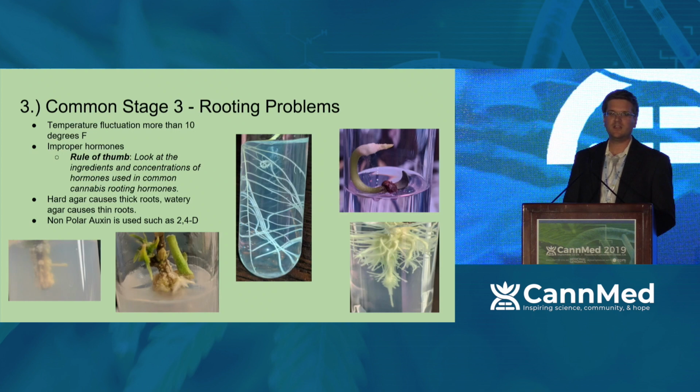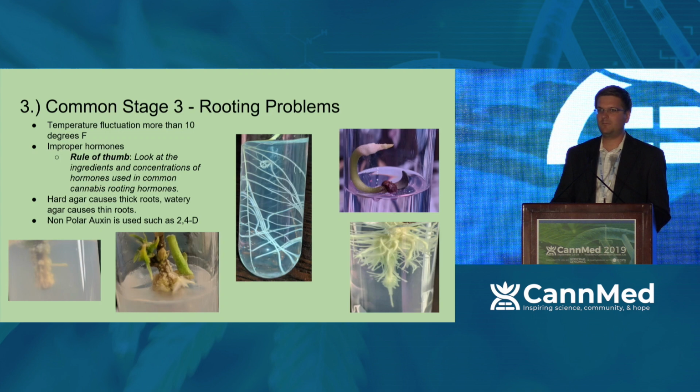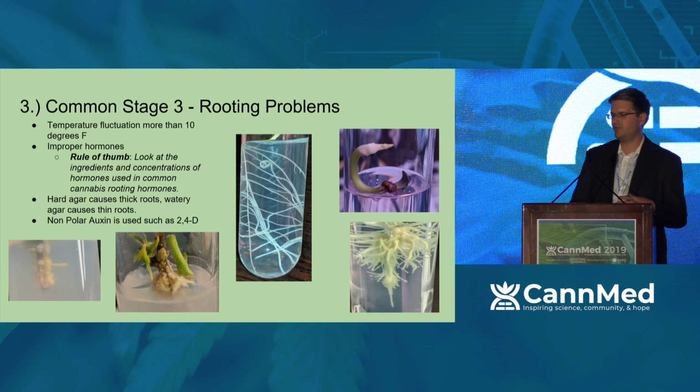And so what I try to tell people when they're trying to create some of these hormone blends or whatnot is look at the compounds or the bottles that you've used as rooting hormones for the rest of your cannabis grow. I mean, people have been doing this for years. Why not pay attention to the IBA concentrations on the back of Clonex or Hortus or Hormex? If you start looking at those and you actually utilize those ratios and some of the additives they're putting in, you're going to be a lot more successful at rooting your culture in vitro.